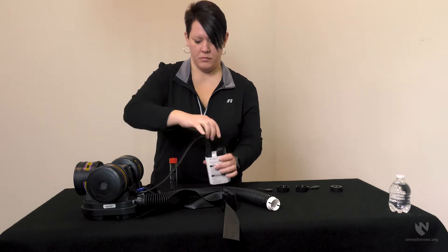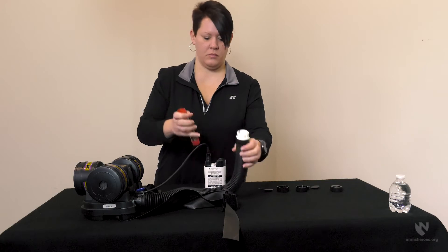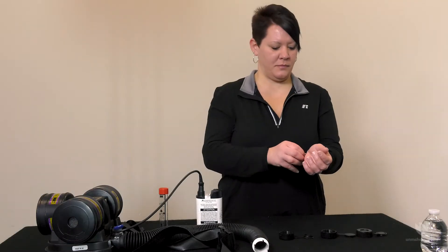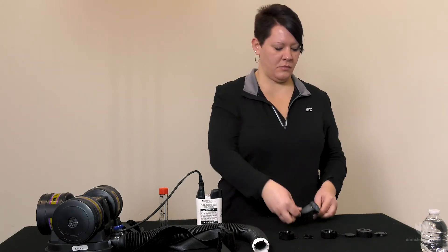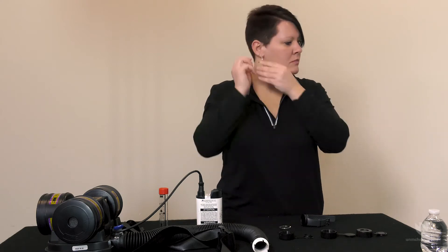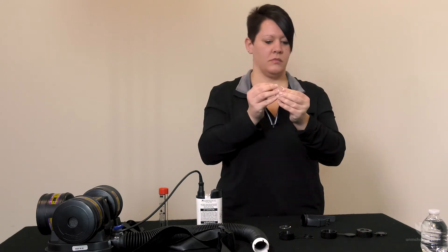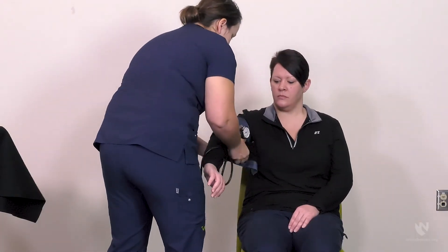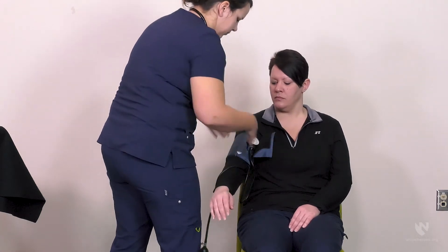Each filter is fitted with caps which will need to be removed prior to attaching the filter to the PAPR motor. Once the filters are attached, connect the battery and test the PAPR motor using an airflow meter. Before donning any of the equipment, remove all jewelry and other personal effects. The donning partner should then take and record vital signs of the personnel donning the suit. It is recommended to drink one to two glasses of a non-caffeinated beverage prior to donning the suit, as remaining hydrated while wearing the suit is very important.